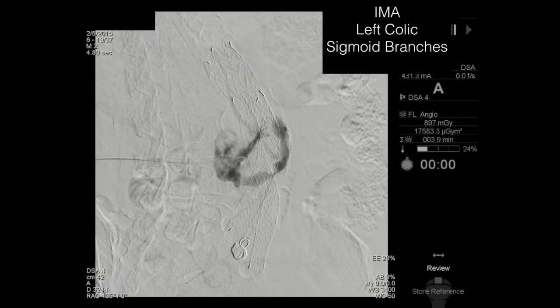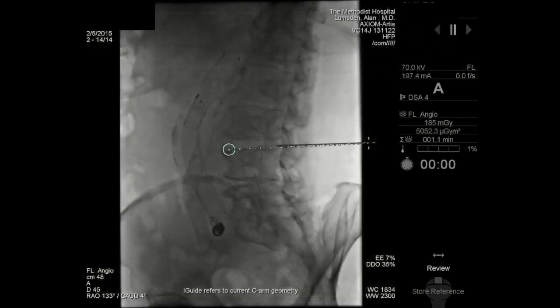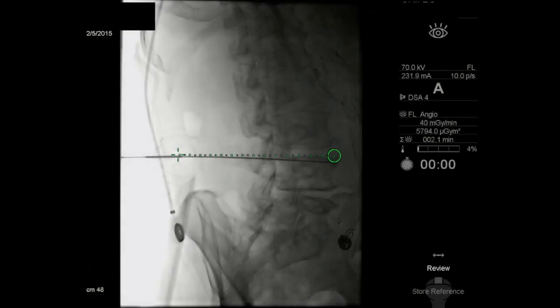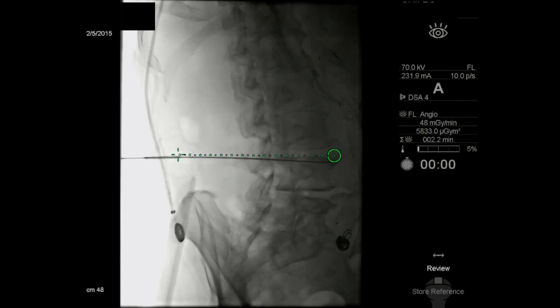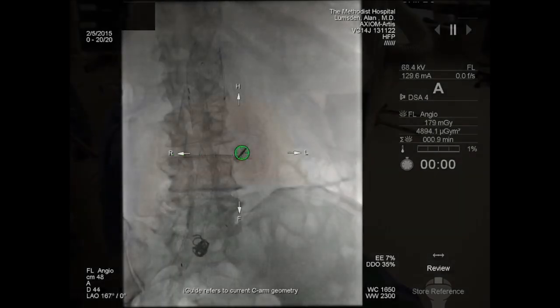This is a patient where we did access using translombar guidance for an enlarging aneurysm. The needle has been introduced into the aneurysm sac; we've injected dye, and now you can actually see the left colic and the sigmoid colon branches. Once you get access like this, you simply go ahead and work much like you do any other endovascular procedure. This is what the trajectory looks like where we push the needle down — we're slightly off at the apex, but otherwise this is a fairly safe way of gaining access into an aneurysm sac in a very controlled and stable manner.